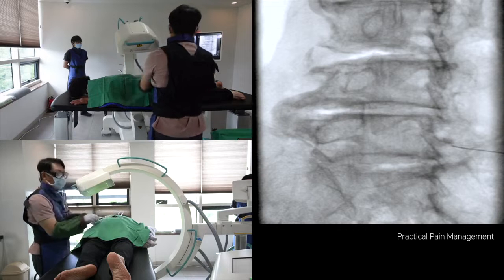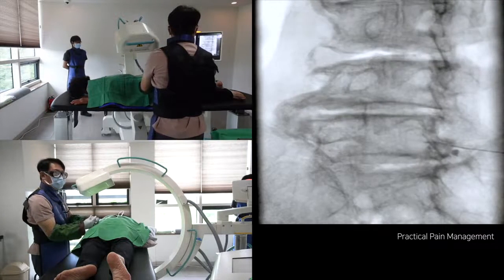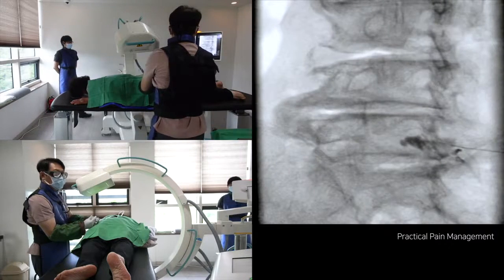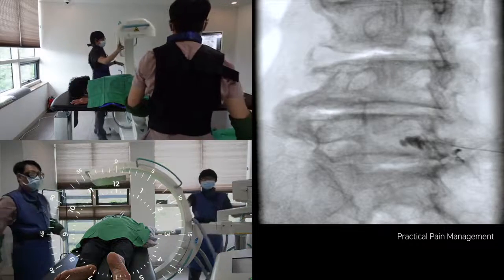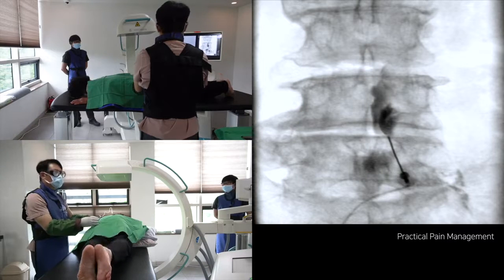I will connect the mini volume tube to the spinal needle and the contrast media-filled syringe, and then slowly pressurize the syringe. The contrast begins to disperse to the epidural and foraminal space. The AP. Thank you for being so cooperative.